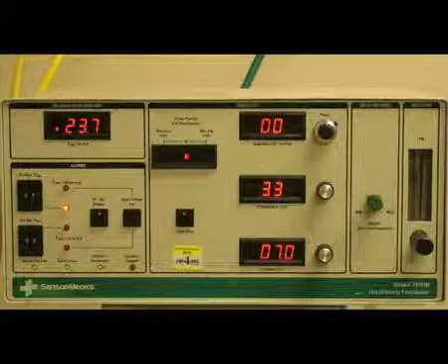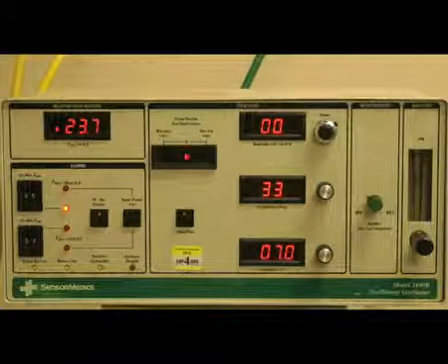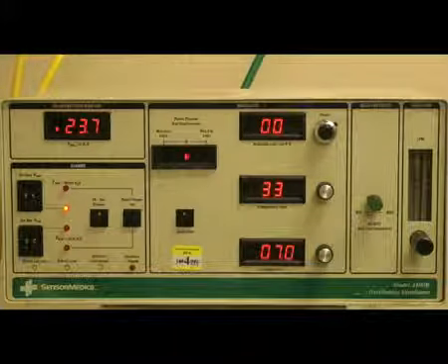Referring back to recruitment maneuvers, if a patient becomes disconnected from the oscillator for any length of time, it is a good idea to perform a recruitment maneuver immediately after hooking the patient back up.